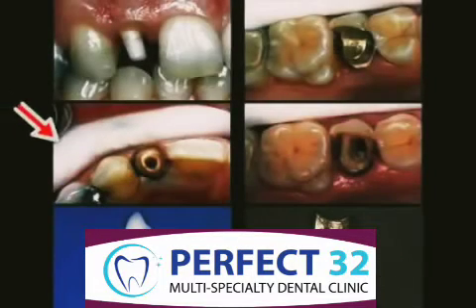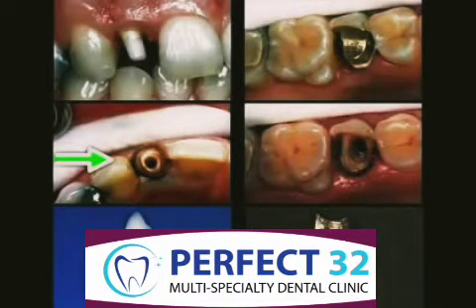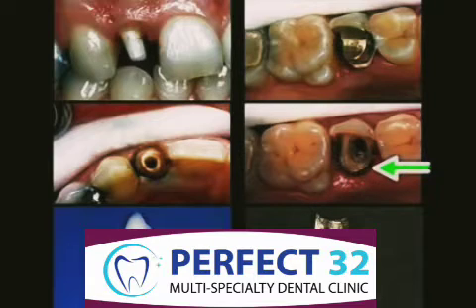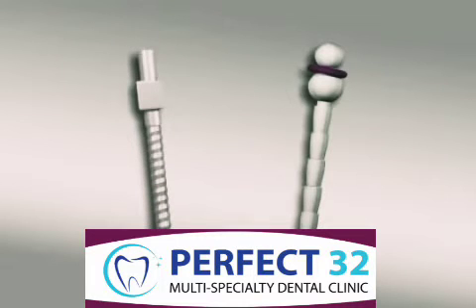Posts can be separated into two groups, pre-manufactured posts and those custom-made by the dental technician. For example, on the left you see a pre-manufactured glass fiber post. The core buildup is on the top. In the middle you see the excavated tooth core, and on the bottom you see the pre-manufactured glass fiber post. On the right you see a custom-made metal post. Again, the tooth core is on the top, the excavated tooth core is in the middle, and the custom-made metal post is on the bottom. Nowadays, pre-manufactured posts are used more and more often, as can be seen in these images. These are increasingly made of glass fibers.